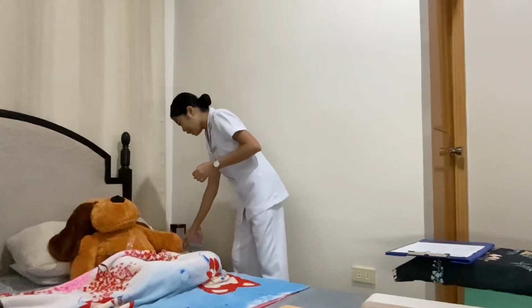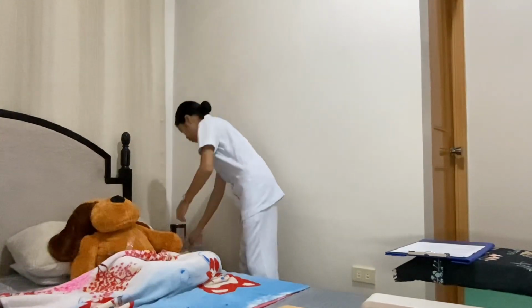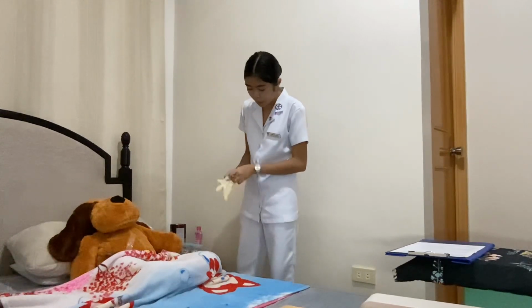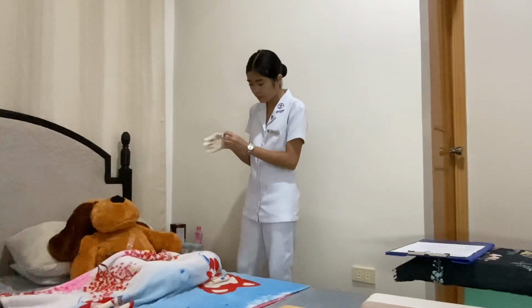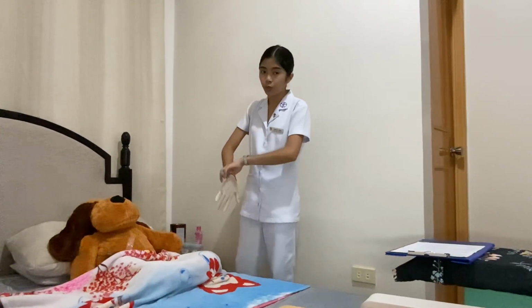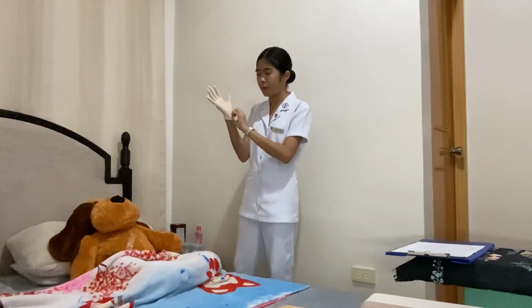And also, as we try to select the injection site, we should also inspect for any lesion, for any redness, for any tenderness, hardness, or swelling or inflammation that you may feel on the area. At the same time, we're going to wear our gloves, which serve as our protection from bodily fluids, and also to avoid cross-contamination between me and my patient.